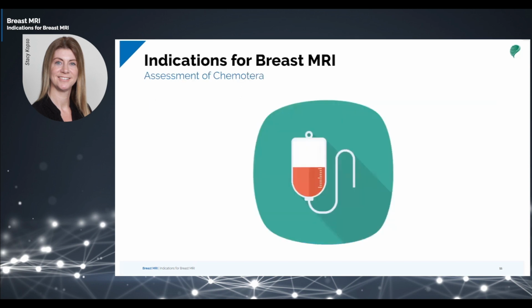Breast cancer patients often undergo several MRI screenings before, during, and after chemotherapy sessions to compare tumor size and extent as treatment progresses. Comparing the results of these scans shows how well the patient is responding to treatment and helps with tailoring the treatment plan process.